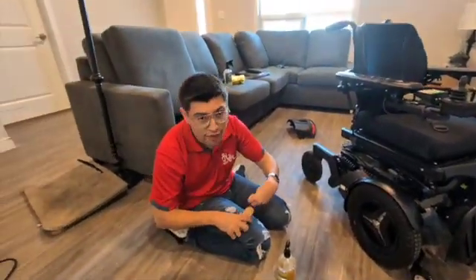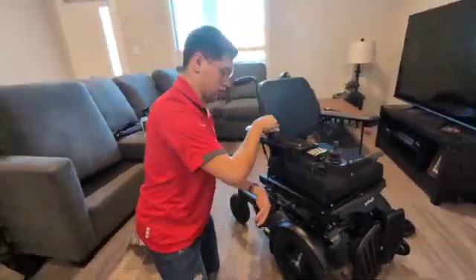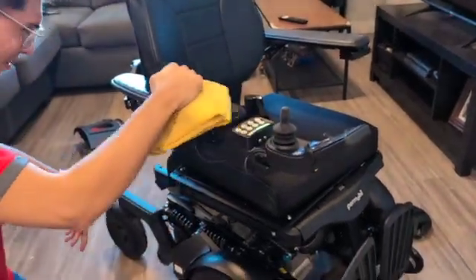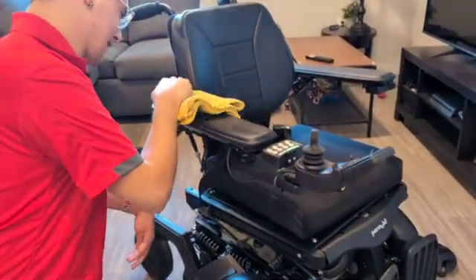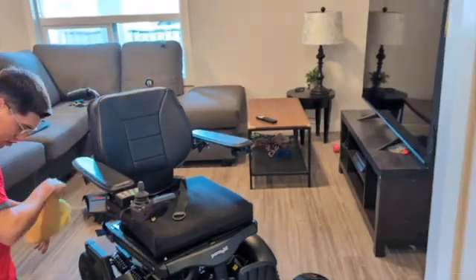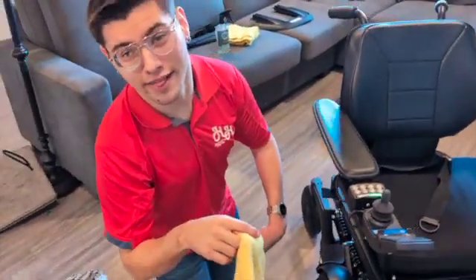Take your leather cleaning brush and scrub it. Once you have it clean, just simply wipe it off. This stuff is amazing. Even though the bottle sucks, it works. It's pretty clean because it's brand new, but I'm still going to clean it anyway.